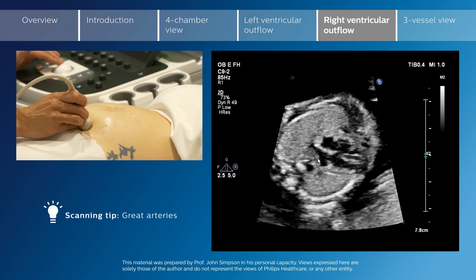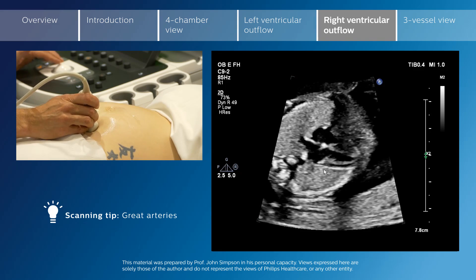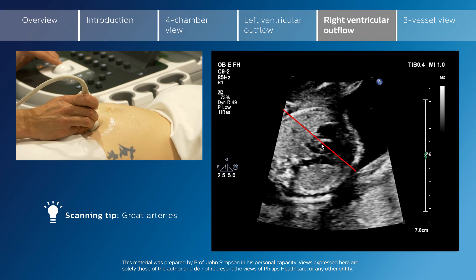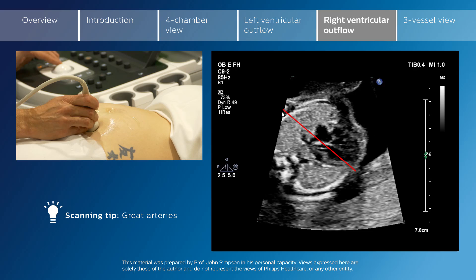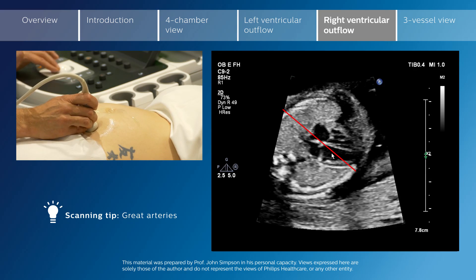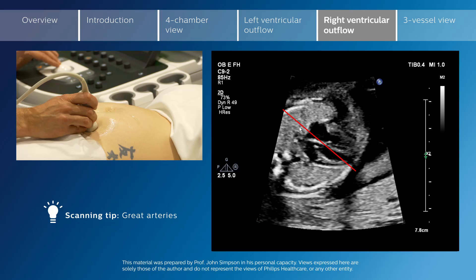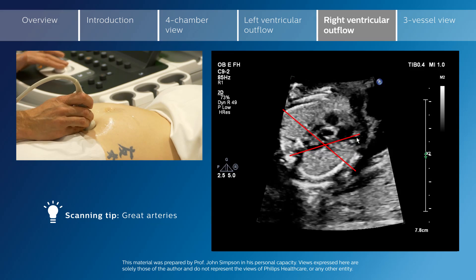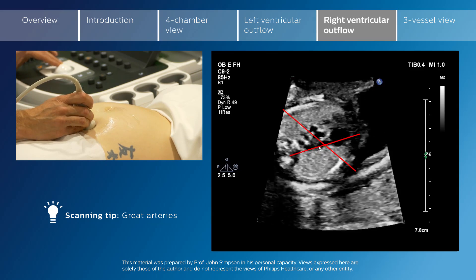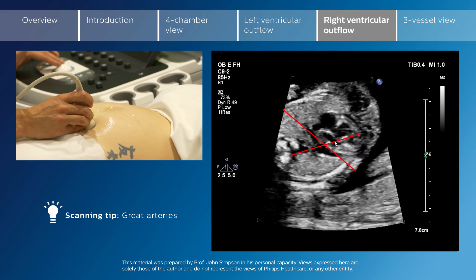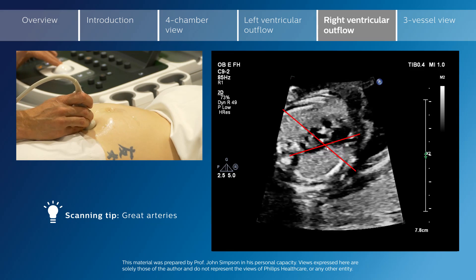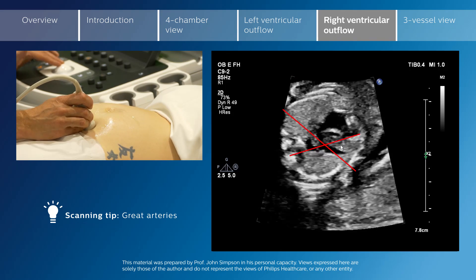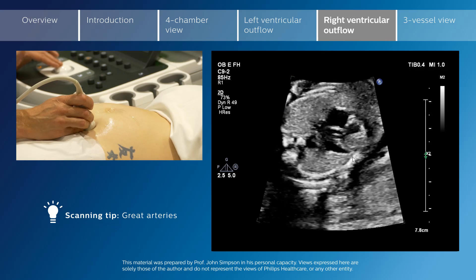The great arteries cross in their orientations as they leave the heart. As we sweep cranially, the aorta leaves the heart heading towards the fetal right shoulder, whereas the pulmonary artery heads more or less from the front of the chest back. So the great arteries cross as they leave the heart. You should not see the vessels as they leave the heart lying in parallel — that would be strongly suggestive of transposition of the great arteries.